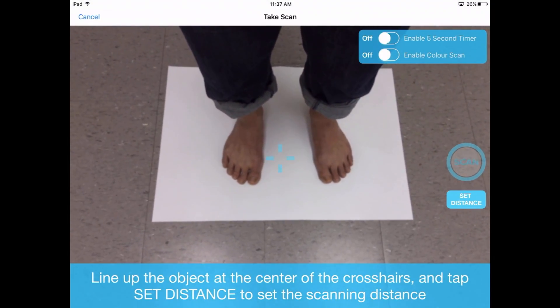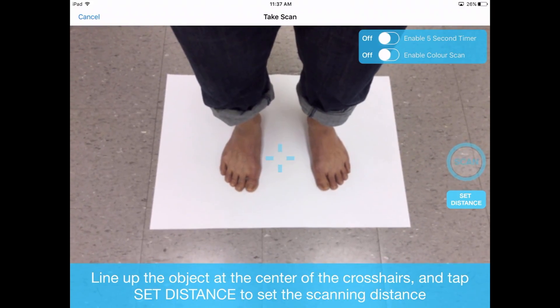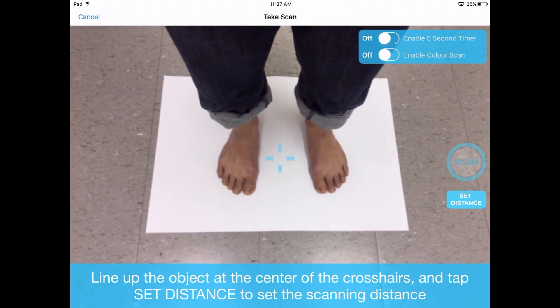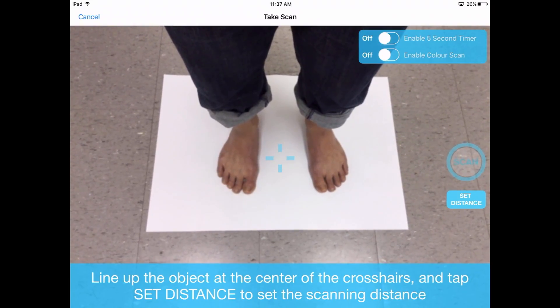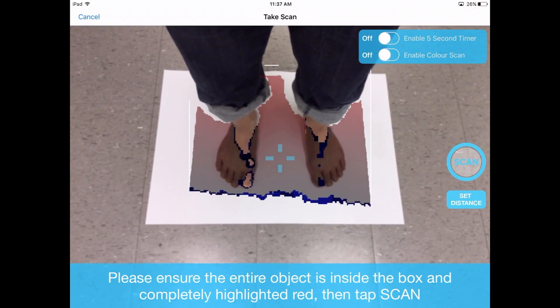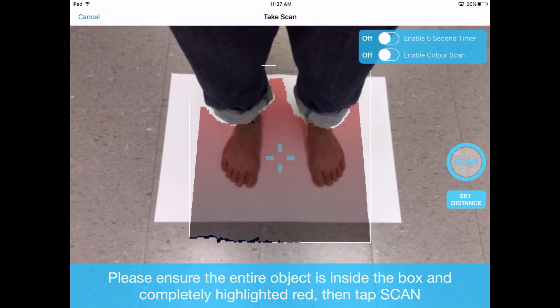Use the crosshairs in the center of the screen to point in between the two feet. Advise the patient to stand feet shoulder width apart. Press the set distance button and a box with a highlighted color will pop up. Move back distally away from the feet.